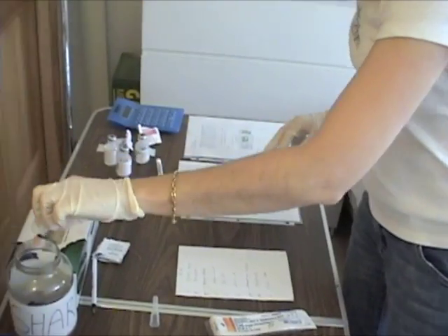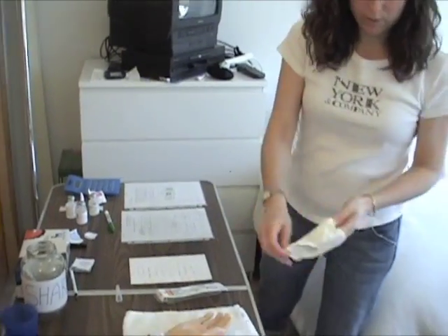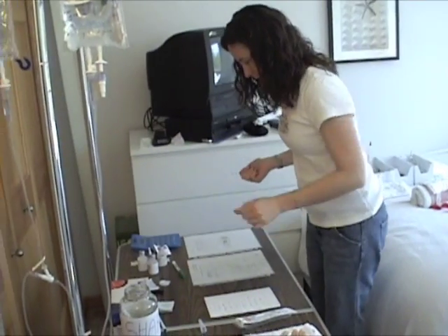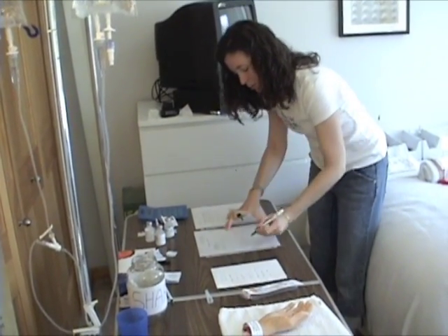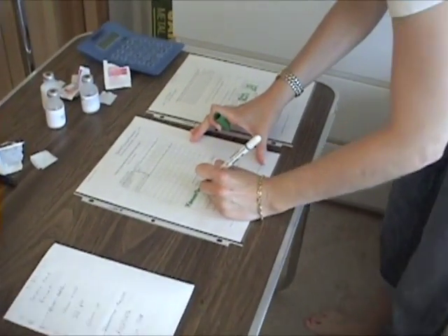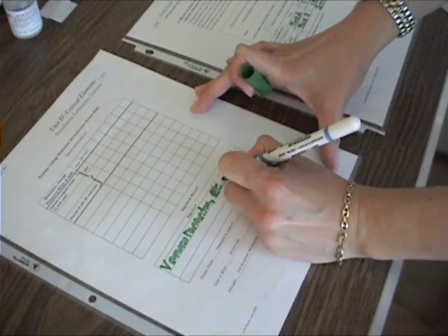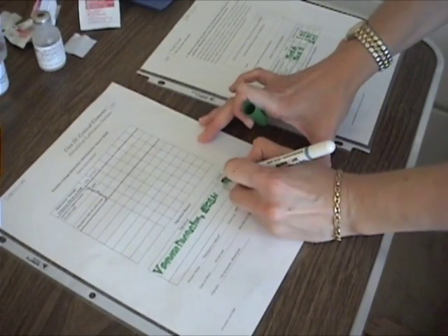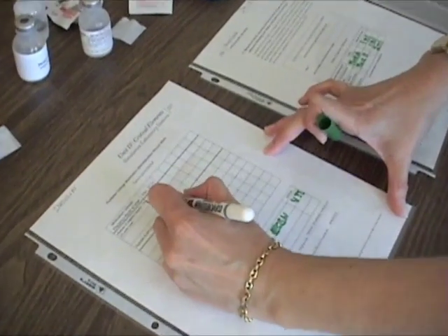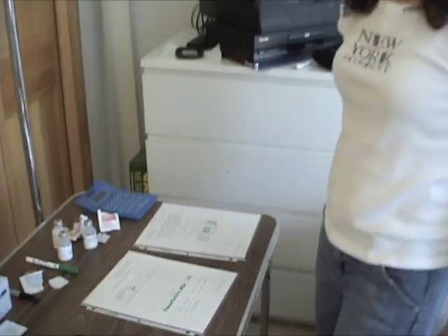The needle straight in the sharps containers. Remove your gloves. You'll wash your hands. And then the final thing is to just sign the MAR. Make sure you put your Excelsior College student nurse, your initials, and then the initials up here. And this is it for the IM injection.